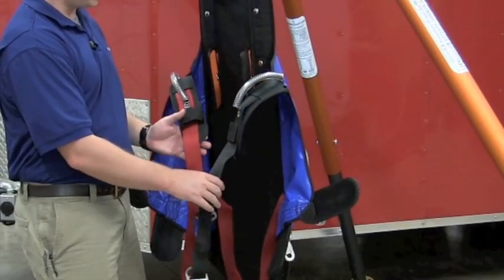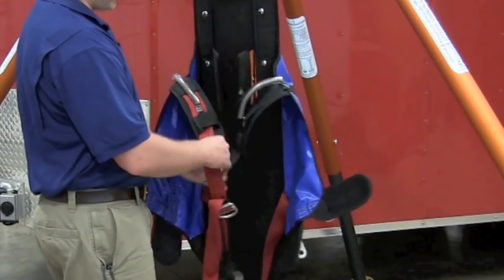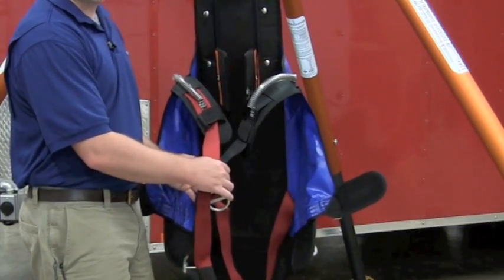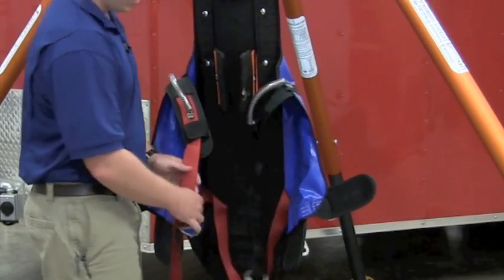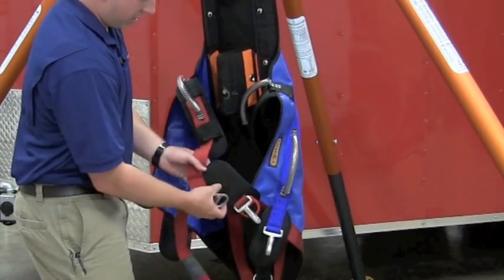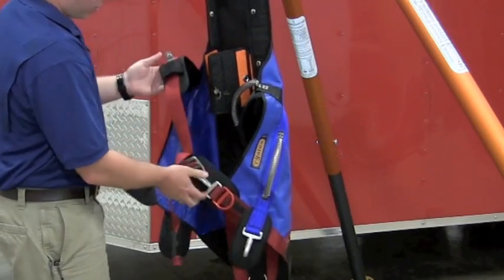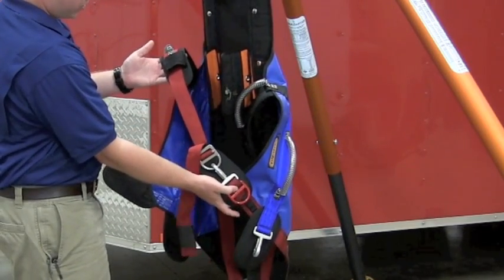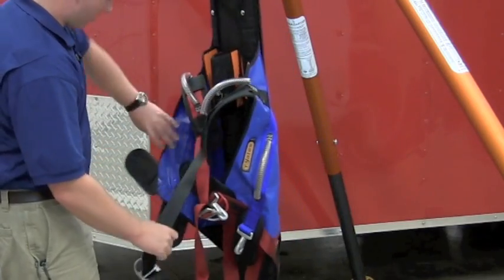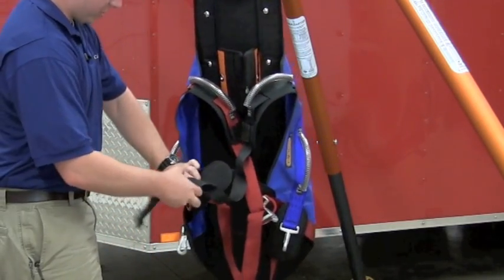Working our way down the harness, you have two shoulder straps. These straps come across the shoulders and diagonally across the body. One's red, one's black. So all you have to do is connect red to red and black to black. When you fold over the sides of the Spec Pak, you'll see that you have some snaps to connect it across, and they're color coded so that you can make sure you connect the right ones to each. So black to black and red to red. These will come across the patient's body and over the top of their shoulders.